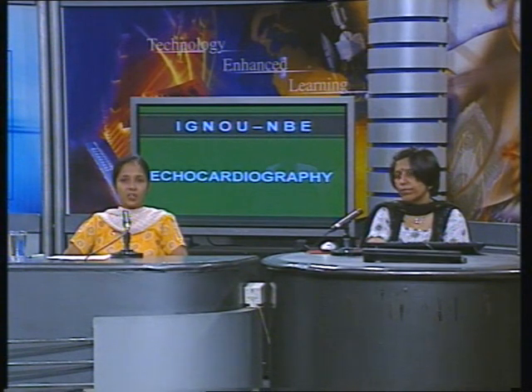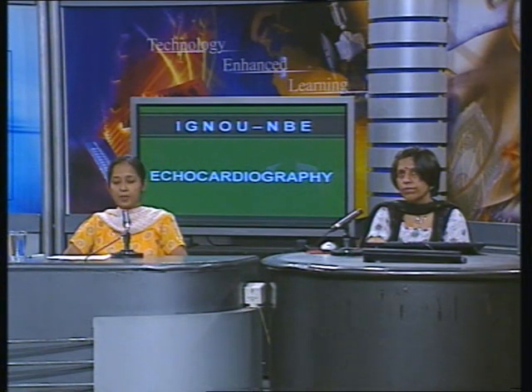Basics of echocardiography, that was the topic of our second session of teleconferencing program. Our expert was Dr. Sangeeta Sachdeva. We will be back with Dr. Sangeeta Sachdeva in our third session of our today's program with one more topic. The topic will be echocardiography in mitral stenosis.